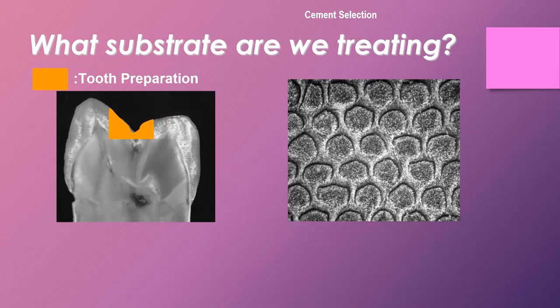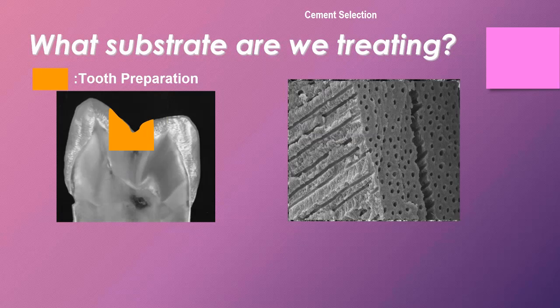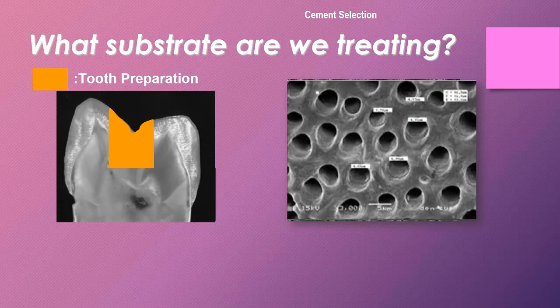So this is where you want to play. You want to be out here, like no prep, minimal prep veneers and onlays where you're on enamel. This is the best place you could ever be if you want longevity. But this is not where we get to play usually, because there's already been a cavity, a filling, or something there that we have to go into the tooth. As we go into the tooth, you can see here we're on superficial dentin. We have lots of tooth, small holes for the dentinal tubules, and not a lot of moisture out here. The highest bond strength possible is right here in this area. This is where you want to be. Hence, minimally invasive dentistry.